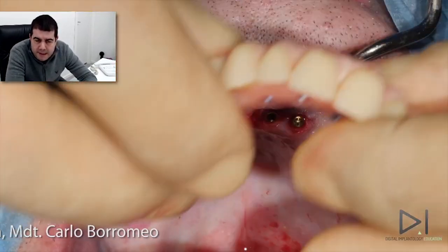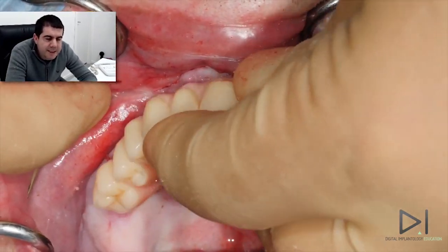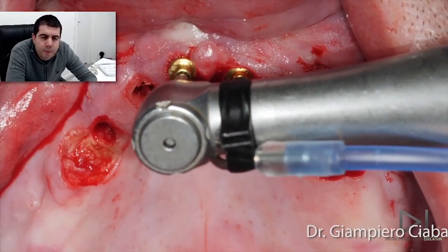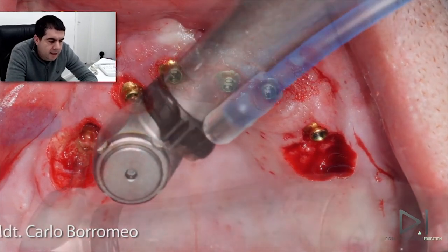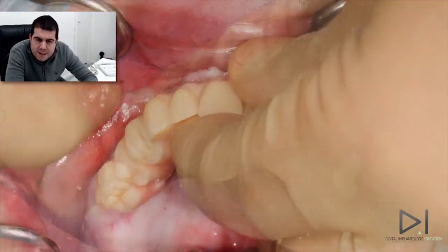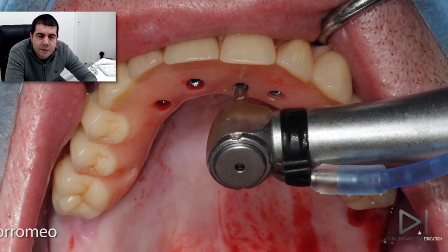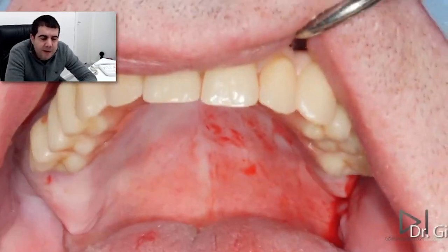The Seeger rings are offering also more advantages, such as avoiding the possible loosening of the screws over time and the opportunity to stabilize one or more implants in our clinical case without any screw needed. This option is indicated by all the clinical trials, with all on 4 applications avoiding to use one screw, with anterior screws in our prosthesis, or even with 5 to 6 implants in the same cases, avoiding to use 2 screws. By using just the Seeger component retention force and not screwing any screw, we can count on a significant aesthetical advantages if the hole is particularly problematic.